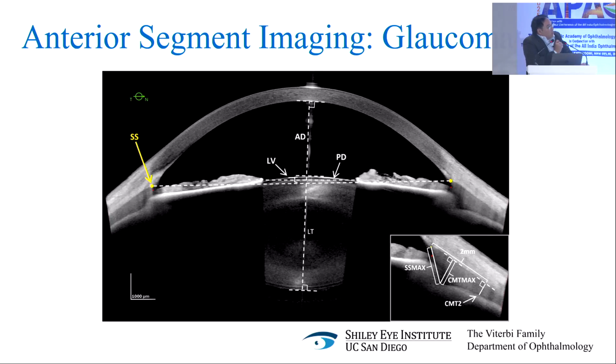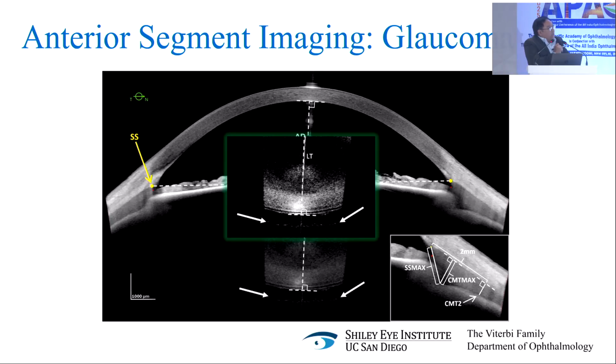Well, with longer wavelength, you can image deeper, and then with tracking and averaging, we can now make out the anterior hyaloid face as well. Look at the space of Berger. This becomes a tool that we can even start to interrogate this deeper anterior anatomy.